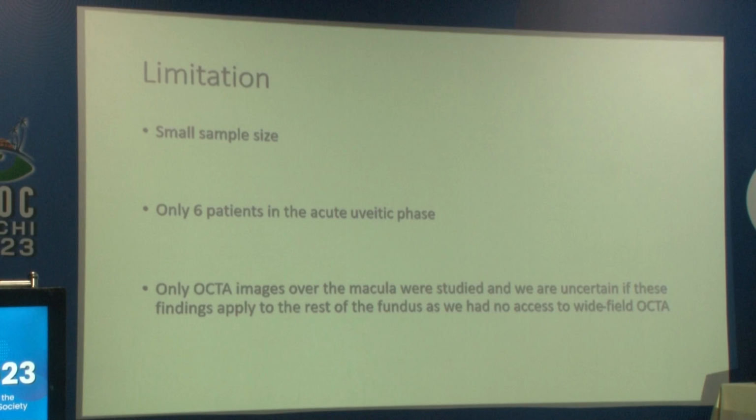The limitations include a small sample size. Only 6 patients were in the acute stage, the remaining were in the chronic stage. Only OCTA images over the macula were studied, and the findings could not be applied to the rest of the fundus as we did not have a wide field OCTA.